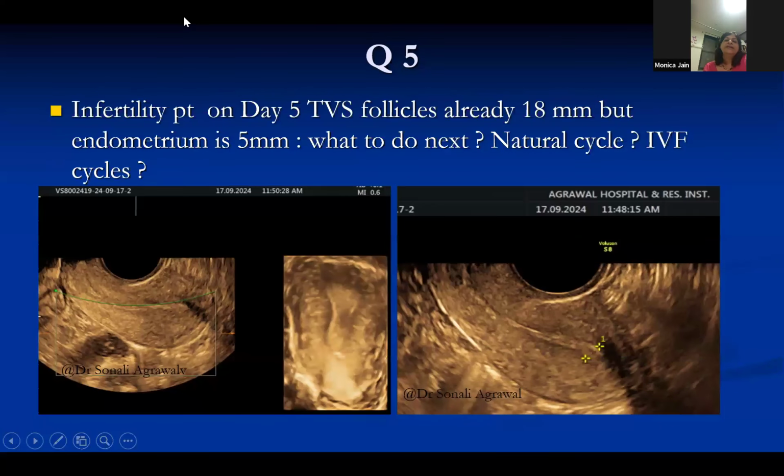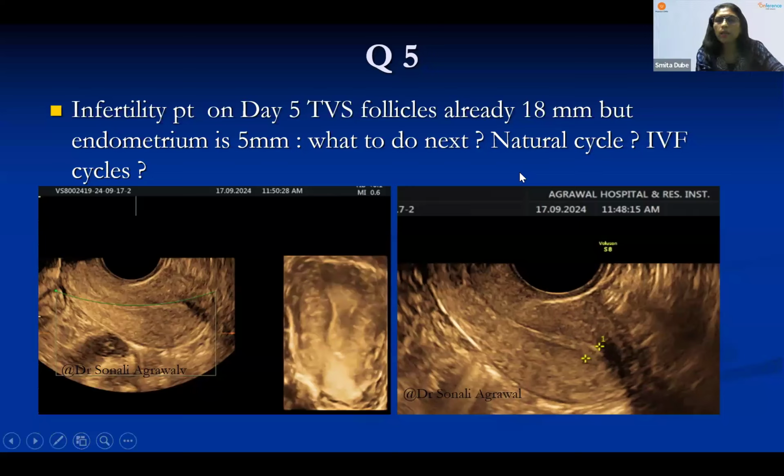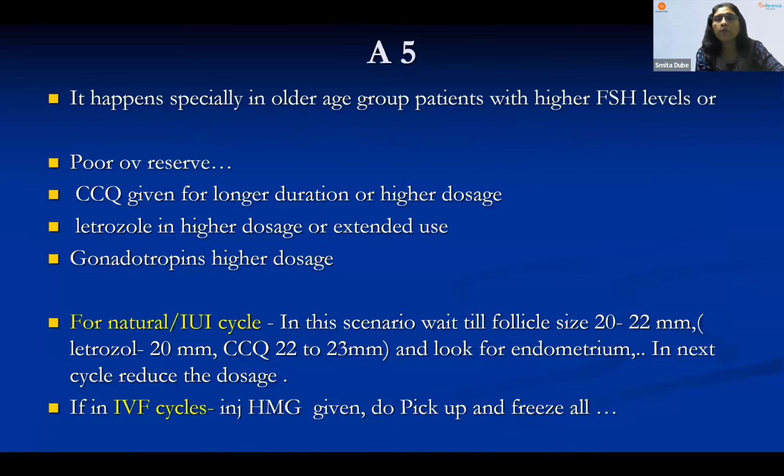If any other follicle is increasing, we can watch, because we have started the follicular study, so we should continue and watch this cycle, and accordingly plan the next cycle. But as Sonal Panchal madam told us, if the follicle is increasing and FSH is very high, then we should not let that cycle go to waste. We should use that cycle also for IUI. So we should rule out whether the ovary is aging or not, and look at the color flow Doppler and other things in the flow also.